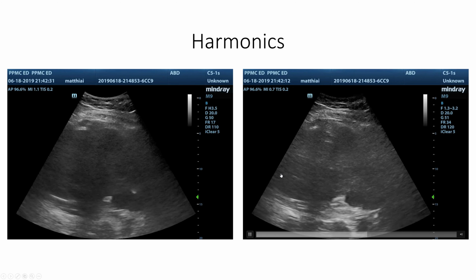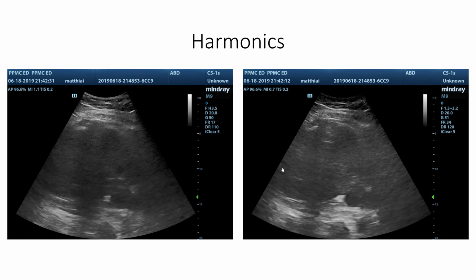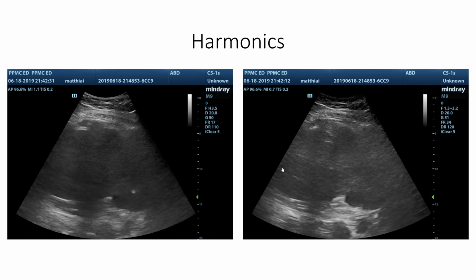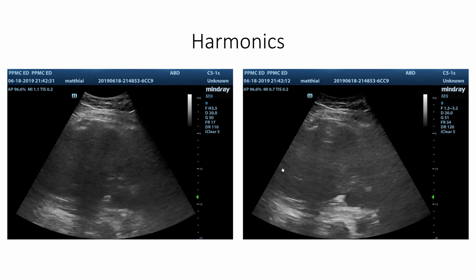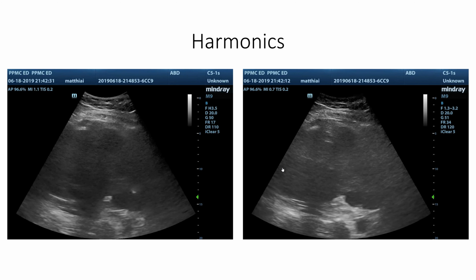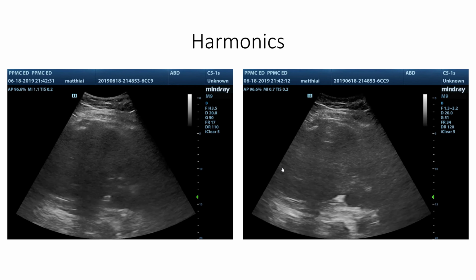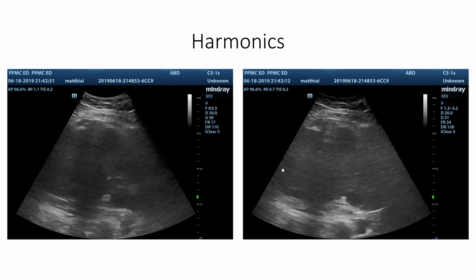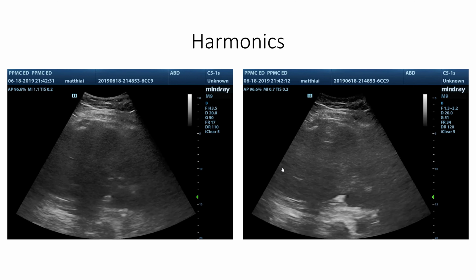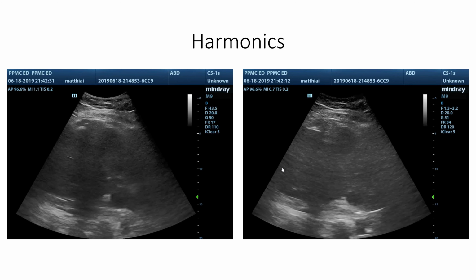That doesn't really come into play in reality at all, because the main type of ultrasound imaging where we get hung up on the frame rate is cardiac imaging, where we want to see a lot of pictures of the heart squeezing so we can make a good, accurate estimate of the LVEF and valve motion and things like that.